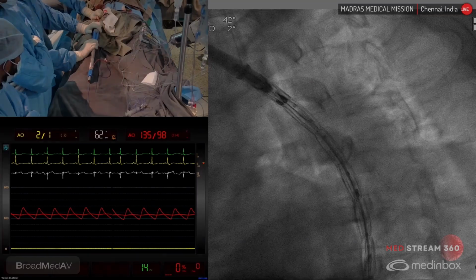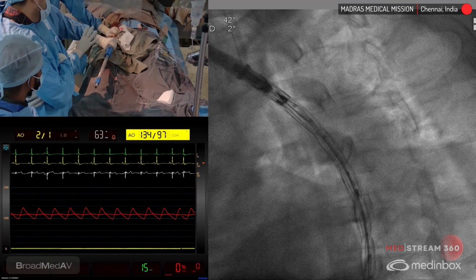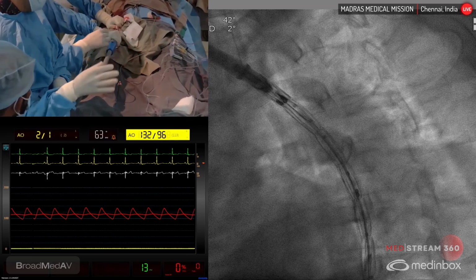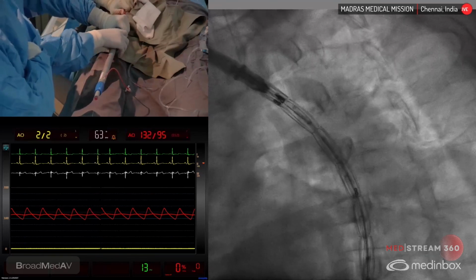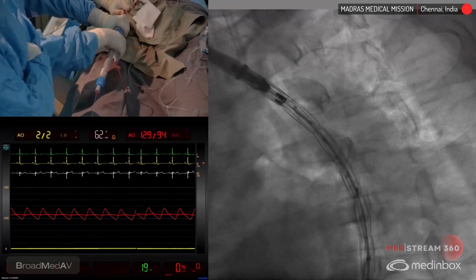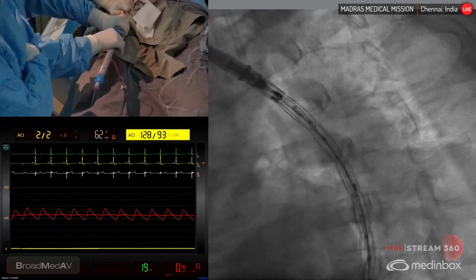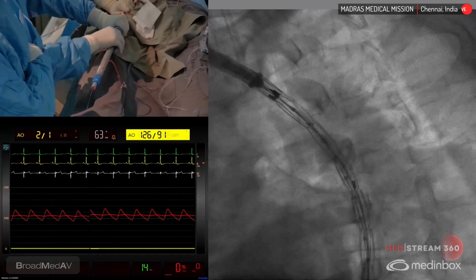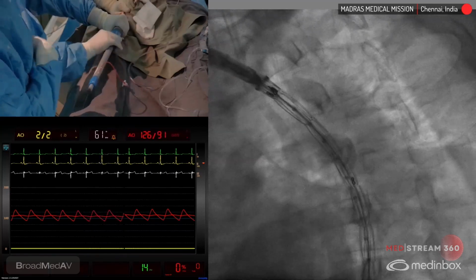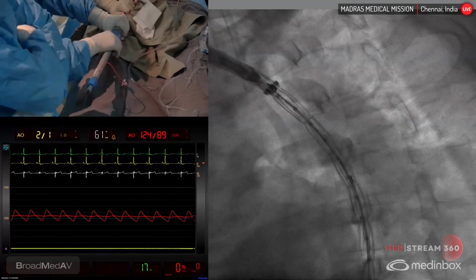You have to hold this hand grip firm so that the stent doesn't move. Then you have to start unlocking this blue. So we'll start. We have to keep an eye on whether the stent is moving or jumping down. So the sheath is slowly coming back.